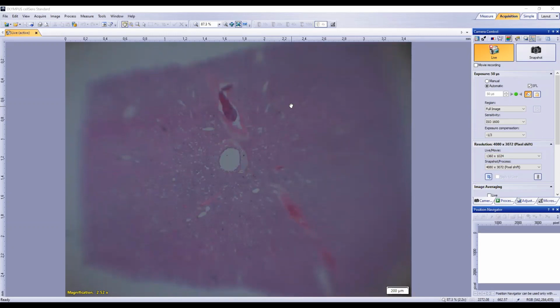Mehmet, you said atelectasis. So what's atelectasis specifically? Are you able to unmute? Or if anyone else wants to jump in? Yep, Stephen, collapsed alveoli, exactly. Atelectasis, consolidation, those sort of terms.